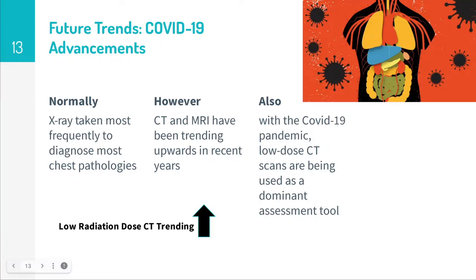A study done by Dr. Anthony Dangus in April 2020 aimed to find out how effective and safe the use of new low-dose CT scan was at diagnosing patients with possible COVID-19. According to the analysis of the results, the mean effective radiation dose for low-dose chest CT protocol was 0.56 mSv, and the median time between image capture and the patient report was 25 minutes. This showed that there was a significant reduction in dose on population level during this pandemic, and that under certain circumstances, chest CT can be used as a significant diagnostic tool for COVID-19.